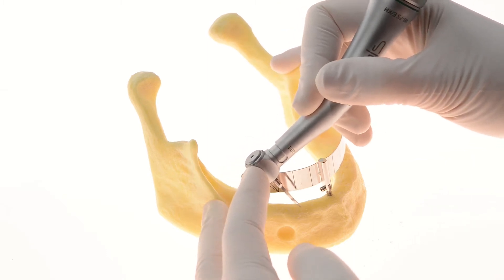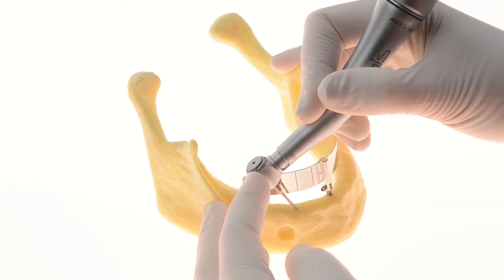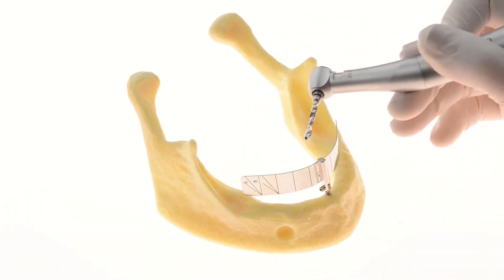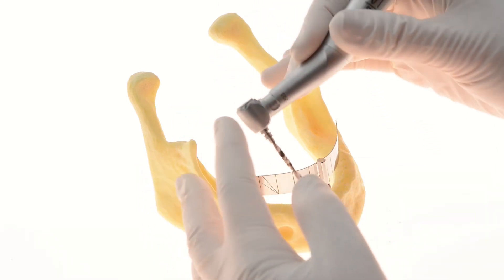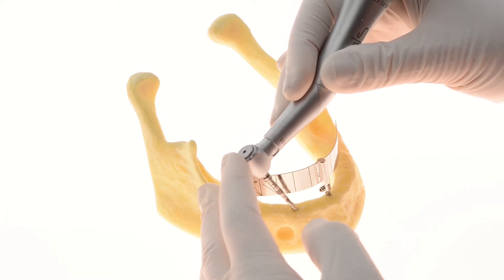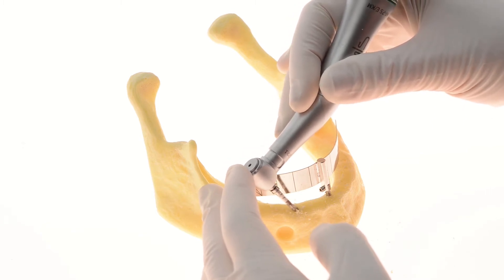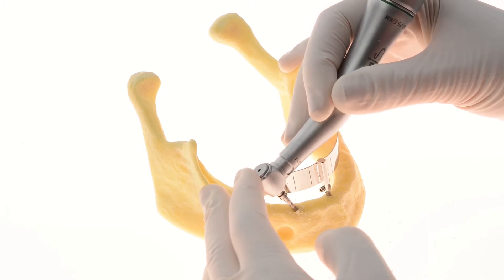Begin the drilling sequence for the longer tilted implants in a lingual to buccal orientation for better stability. Use the mental foramen as your landmark, ending the drilling anteriorly to it.